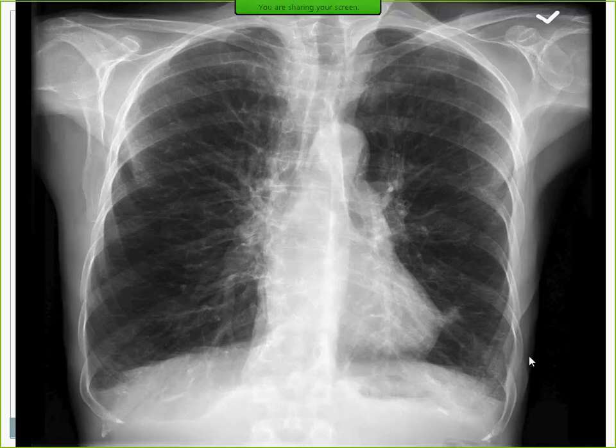So these two patients with hypoxemia, you need to manage them differently, and you need to be astute to figure out what you are going to use, either PEEP or FiO2. You may need to use both, but we frequently don't tend to use PEEP, but there are a group of patients where you need to use PEEP much more than FiO2 to fix their hypoxemia. And I just wanted to make sure that I pass this message across the board. So you don't just allow respiratory therapists to manage the ventilator, you guys participate in managing this machine.